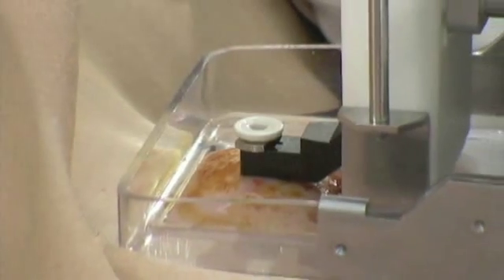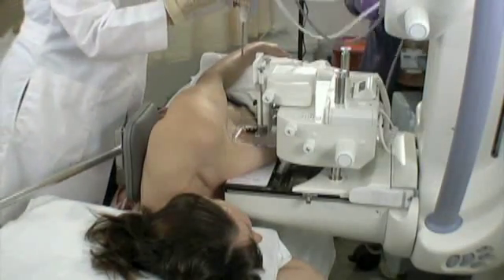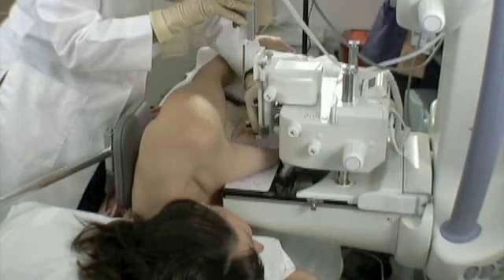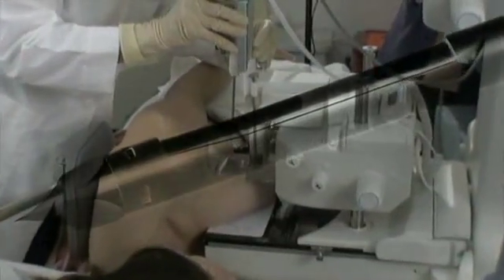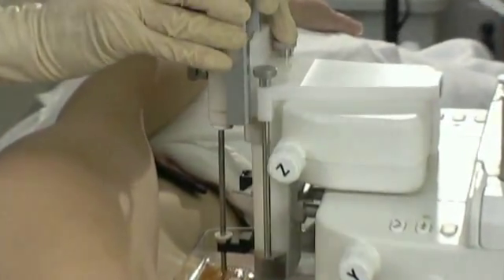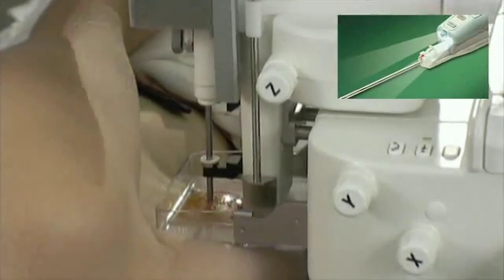I'll go ahead and take the Centrex needle, remove the cover, then lift the needle guide up just a tad from the skin and guide this needle onto the holder and through the guide. You're going to feel me pushing on you. I have it lined up beautifully, so I'm going to push firmly. Excellent — needle's in place.